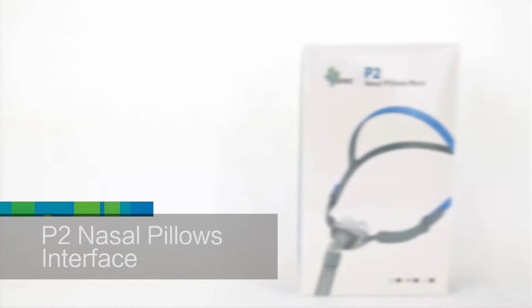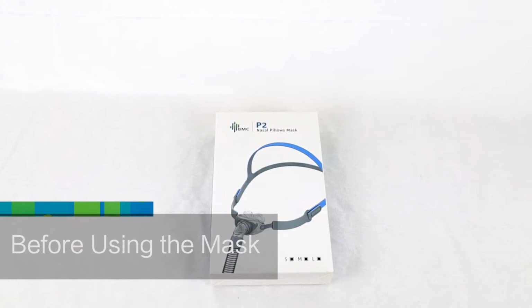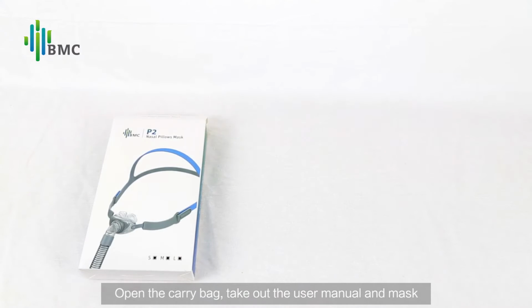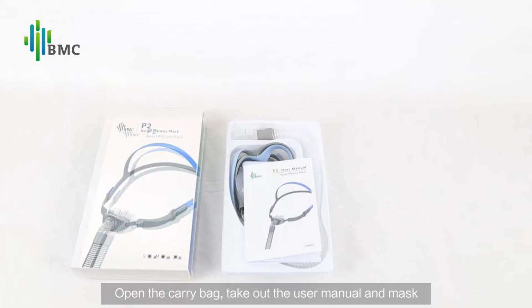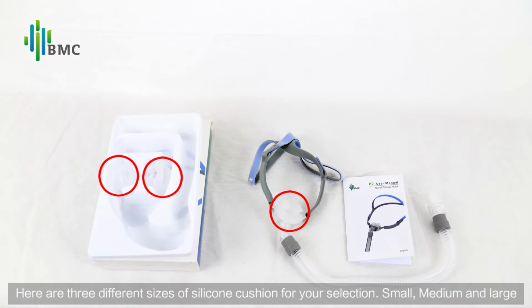Mask User Guide. Before using the mask, open the carry bag, take out the user manual and mask. Here are 3 different sizes of silicone cushion for your selection: small, medium, and large.